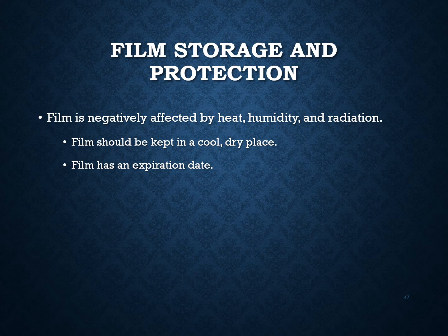And so every film has an expiration date, which is found on the box where you got the film. So they all have a shelf life. If you look at page 69, you'll find all of the humidity and temperature information. These are very important. I want you to take a look at these before you take your quiz.